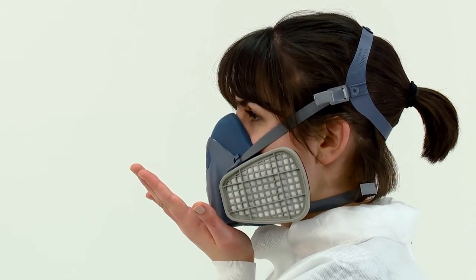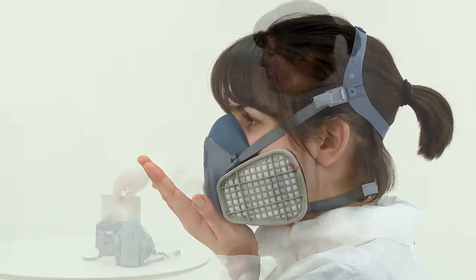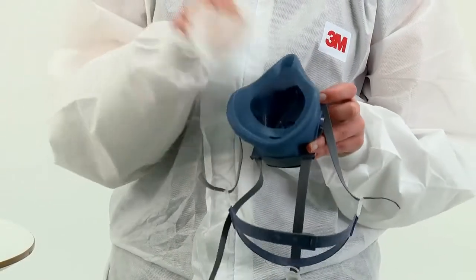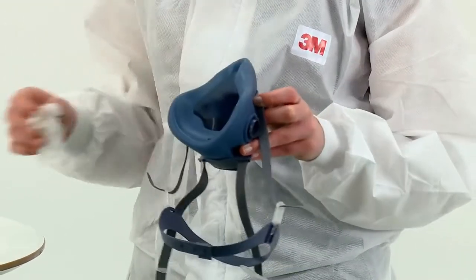If you cannot achieve a proper fit, inform your supervisor and do not enter the hazardous area. The respirator should be cleaned at the end of each shift, dried at room temperature and stored in the sealed container or bag.